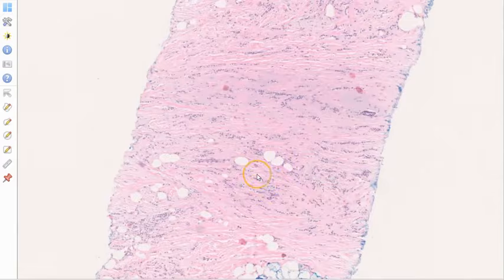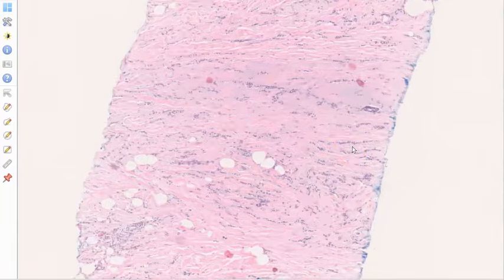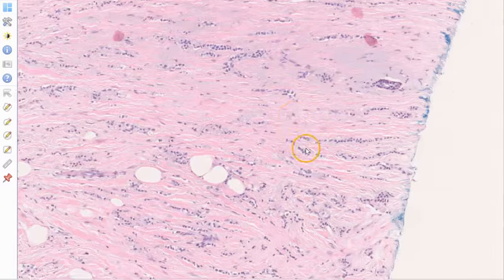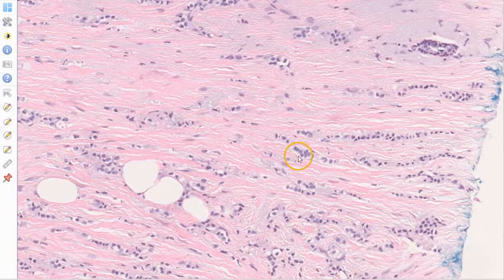Hence, in summary, this is an example of invasive lobular carcinoma of the breast, and we can see that the cells are arranged in these single file arrangements, or just as single cells infiltrating into the stroma. The cells are small with eccentric nuclei and scant cytoplasm, and they do not incite a desmoplastic response. This leads to this tumor being relatively ill-defined grossly, and therefore sometimes it is diagnosed quite late.